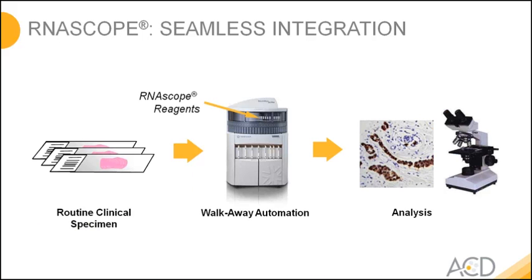Because we have universal assay conditions, and it's easy to do one target or the other, this also opens the door for automation. And scalability means how do you cope with a larger number of samples? And as I said in the beginning, our strategy is to move this technology into the clinical space. Then you deal with a large number of samples. So automation was a must from the very beginning.